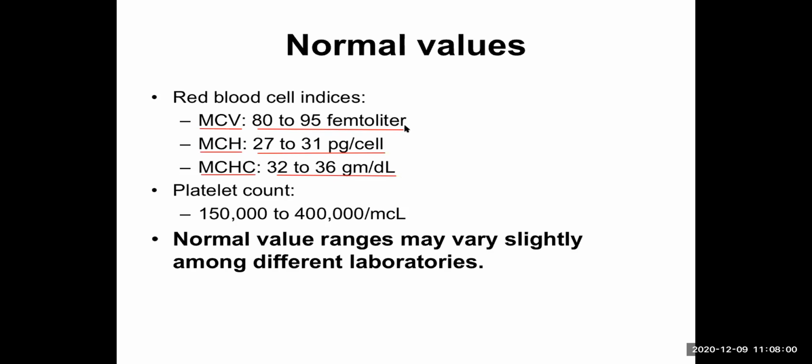Whenever I am looking at a patient with megaloblastic anemia, megaloblastic anemia is an example of macrocytic anemia. The size of the mature RBC is bigger than the normal. So I look at this MCV value. If MCV is more than 100, this is a case of macrocytic anemia. Though it is written 95, we usually take 100 as the clinical reference. If MCV is less than 80, we call that microcyte. So let me mention those terms here.